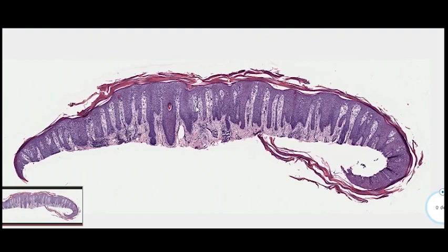What's characteristic for the psoriasiform epidermal hyperplasia is this portion above the dermal papillae, called the suprapapillary portion or suprapapillary plate. And the plate here shows thinning. There are only maybe 2 or 3 layers of keratinocytes here. So we have an acanthotic epidermis with elongation of rete ridges, preserved rete configuration, and thinning of the suprapapillary portion. And as you see here, we have a confluent parakeratosis.